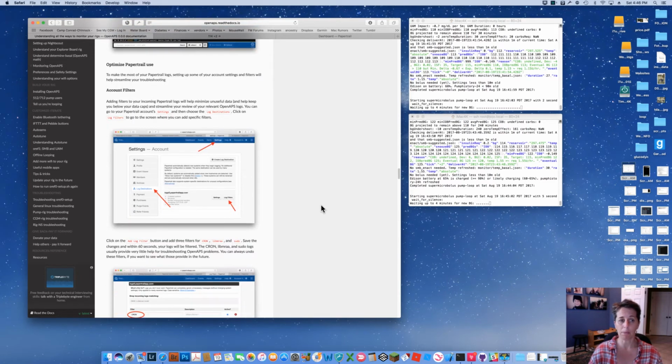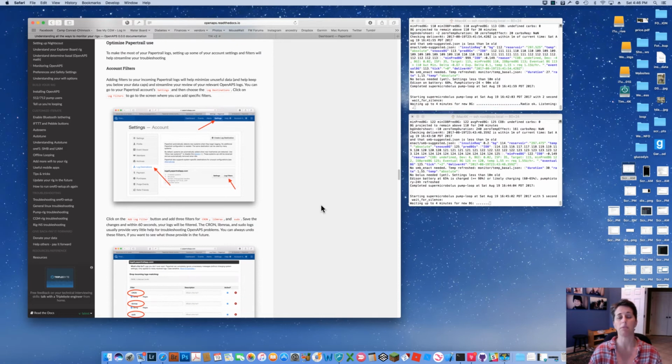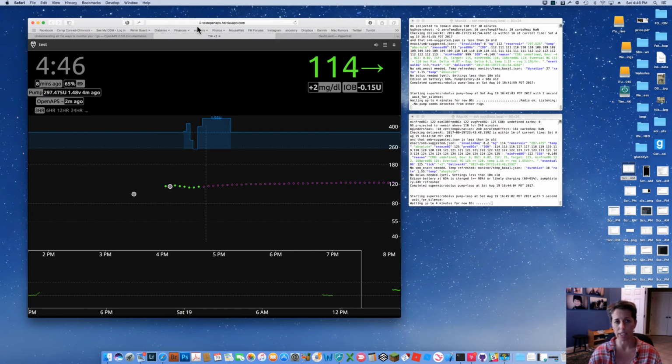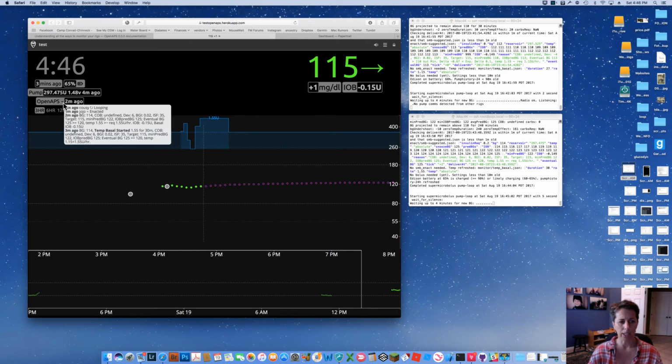But once you get it set up, there's a couple things you want to do to optimize your Papertrail use. And that's the part I want to focus on today, is how you can really get the most out of Papertrail. So I have Papertrail set up on these two. They are feeding this test OpenAPS site. And we can see the pills are there. Both rigs are going. The information is feeding. So it's all on there.